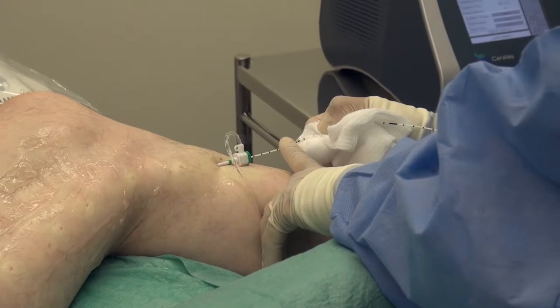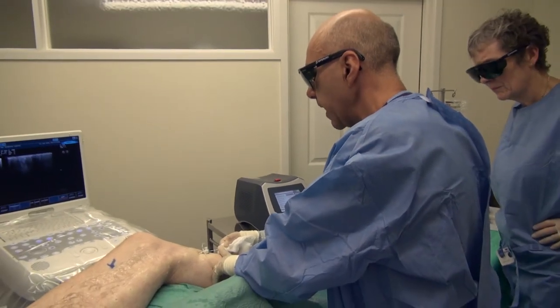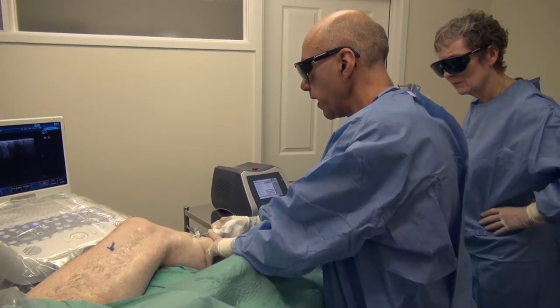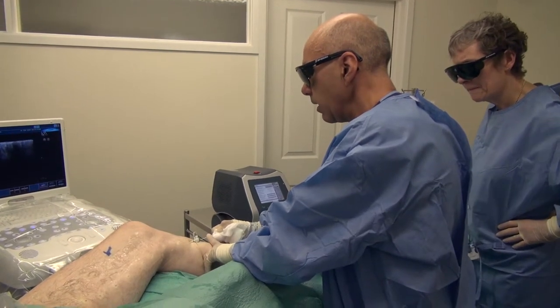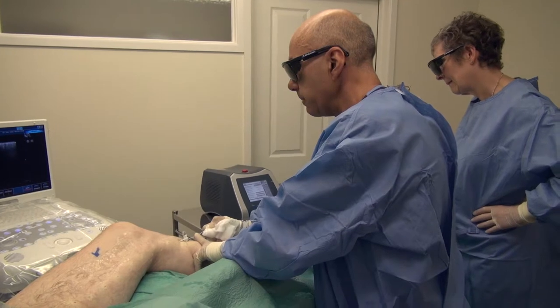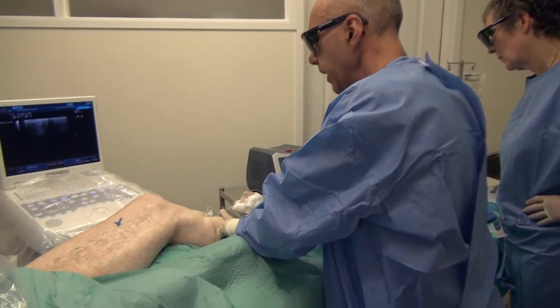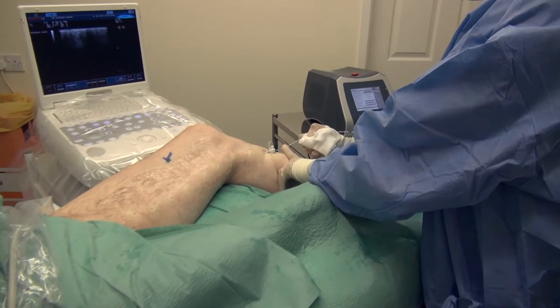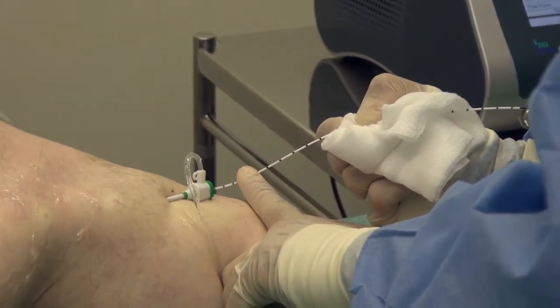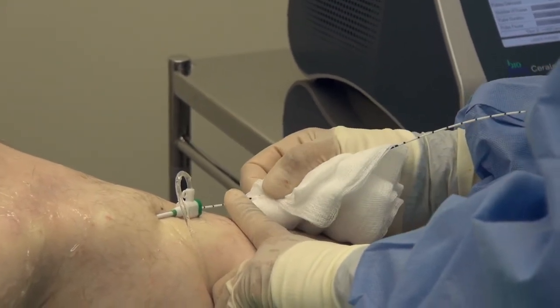Experts vary as to the correct amount of energy that should be delivered to the vein, but based on my reading of the literature and my own personal experience, for a 1470 nanometre laser delivered through a radial fibre using the BioLitex system, I aim to deliver between 50 and 70 joules per centimetre. The evidence in the literature suggests this gives the best outcome in terms of vein ablation rates, together with a very kind and gentle post-procedure recovery with very little discomfort afterwards.